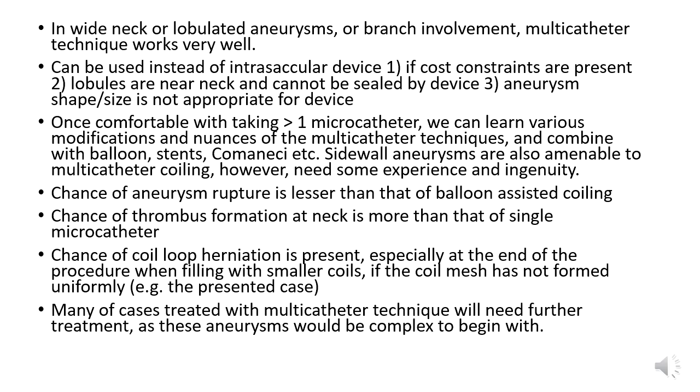Many of the cases treated with this technique will eventually need stent or clipping, because these aneurysms have originally been complex to start with. So we did a good job at the initial point, and some of these cases will stay occluded, but they will need follow-up, and some of these cases do end up with a second procedure, which is more than what you would achieve by straight away clipping or stent-assisted coiling or flow diversion, but the stent-assisted coiling or FDS in the initial ruptured state is to be avoided if we can avoid it. So that is why.